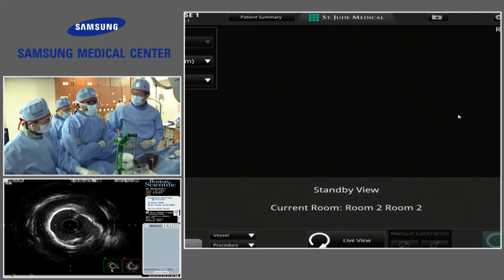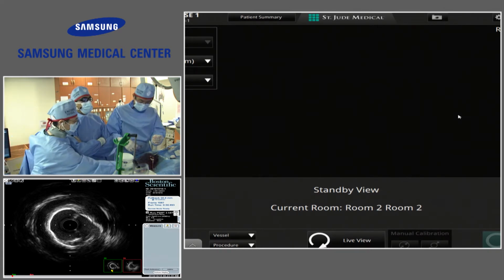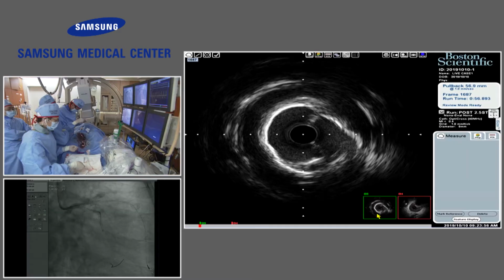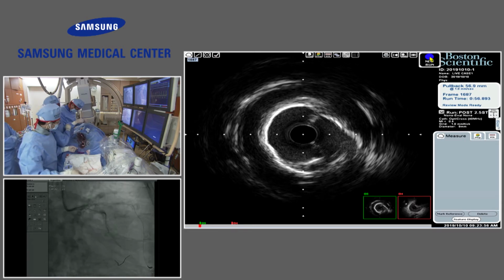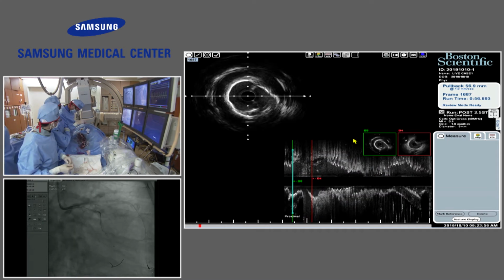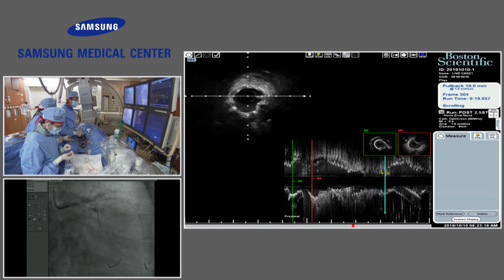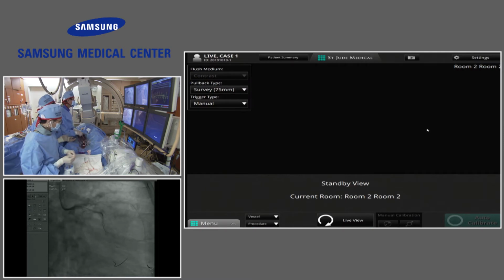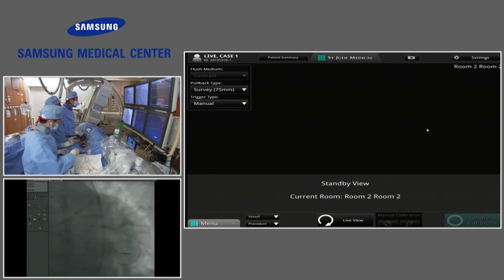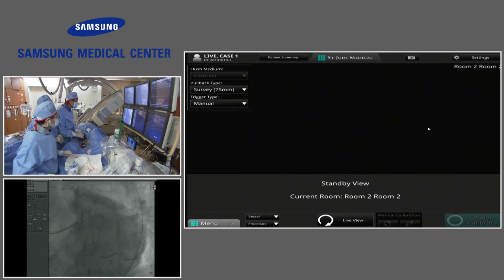I will test myself. The only concern here would be that if we pull that side branch OM wire and the flap occludes the stent, we may end up in a mess because the stent is underexpanded and we could easily end up with the new wire outside of the stent. Can we safely get into the circumflex? Given the size of the hematoma and the compressive effects we're seeing on the IVUS, it would not be difficult for the wire to end up behind the stent.